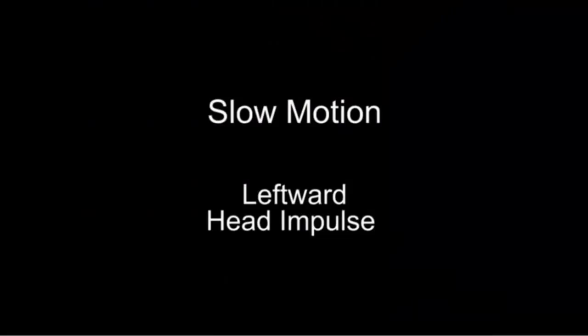So there's a rightward head movement, and you see the catch-up saccade. There's the saccade. There it is again. So it's pretty obvious that this person has catch-up saccades. And then they're going to show you in slow motion as well.